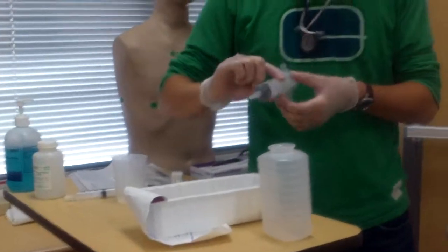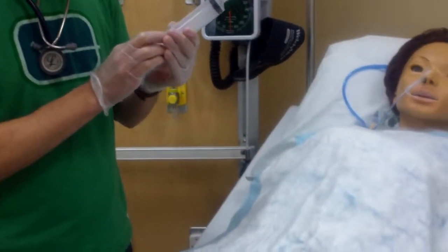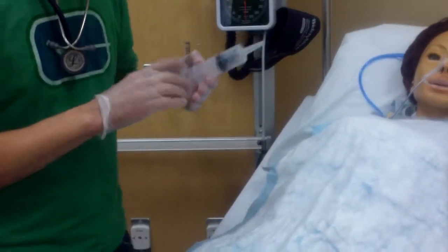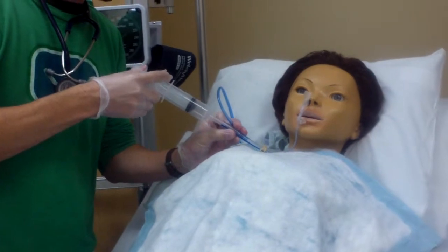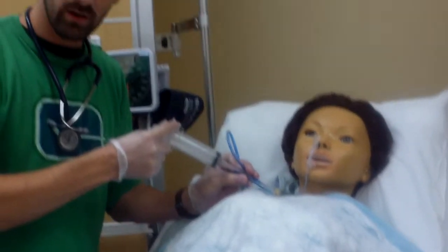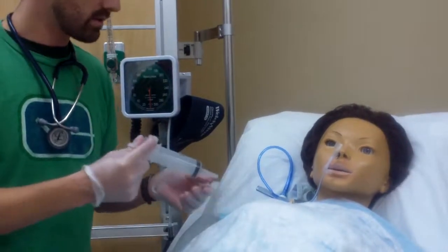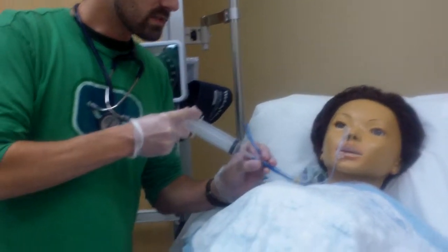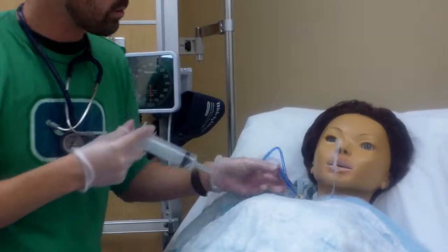I would like to aspirate a little bit of contents, but first I need to flush and make sure it's patent, so I'm going to do 30 mLs of air. And I'm going to flush that in there. I could listen to the stomach and make sure it sounded like a swooshing sound at this time, but I've already checked it. And then I'm going to aspirate a little bit of stomach contents. There we go, I got a little bit.